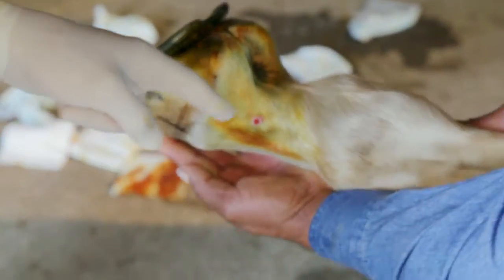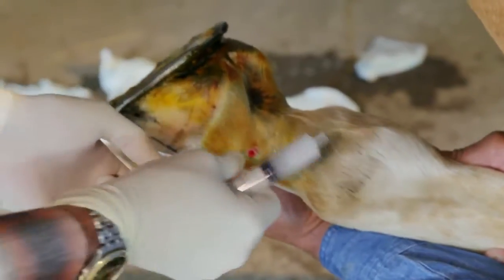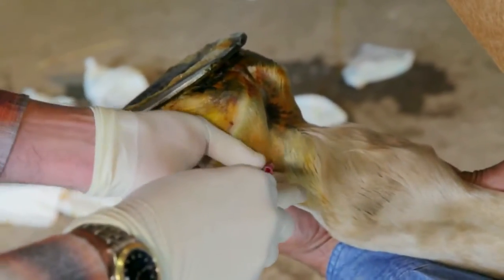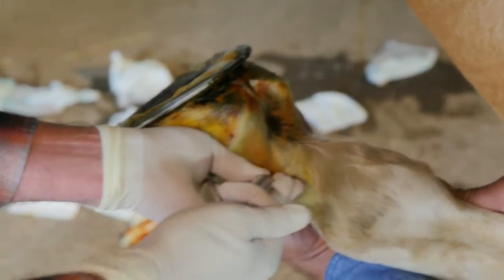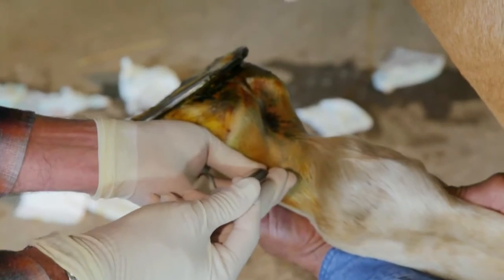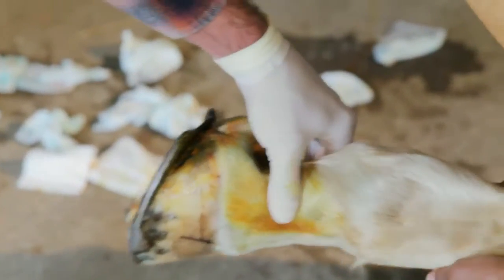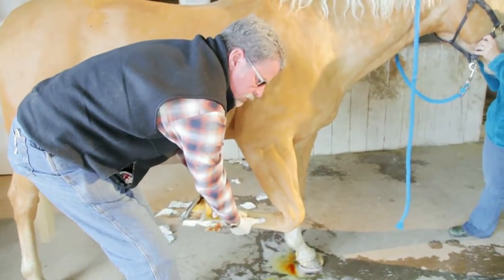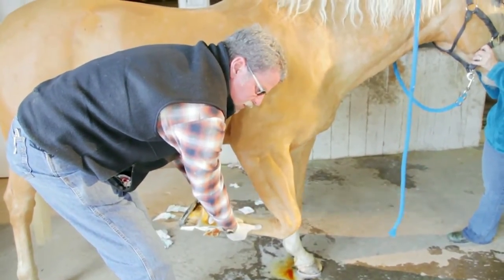There's the joint fluid. As you can see, it's hemorrhagic. We are in the back pouch of it. This is compatible with having early osteoarthritis, DJD joint disease. We have hemorrhagic joint fluid. That was a direct injection into the pastern joint, into the pouch behind the pastern joint.